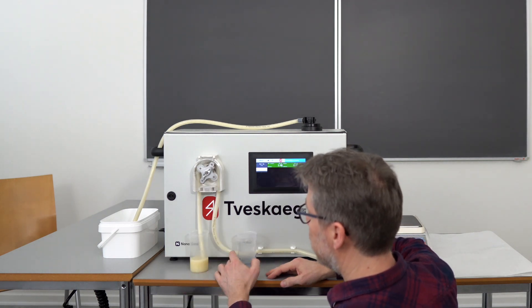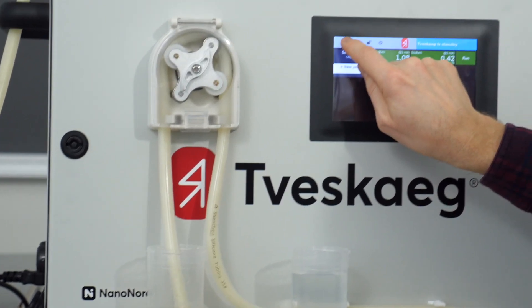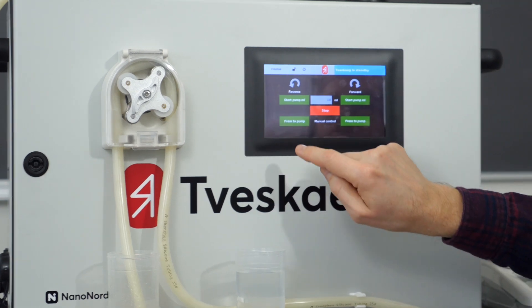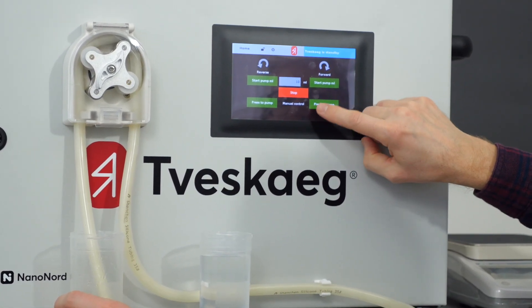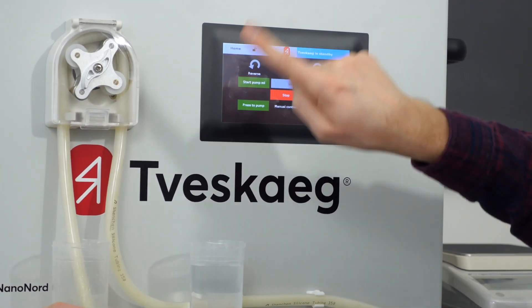You have an old sample normally standing here, so what I used to do is go into the menu, there's a sub-menu called pump — press on that — and I just press on the button called press, which is a manual control that pumps in this direction.